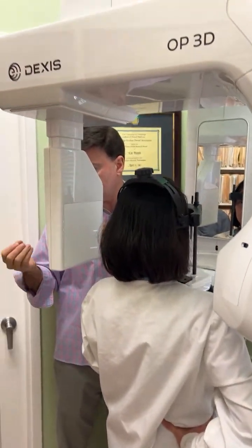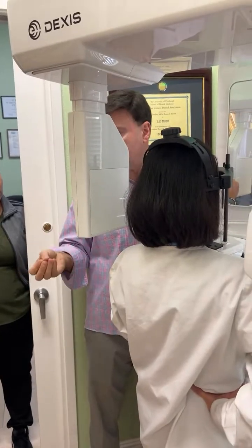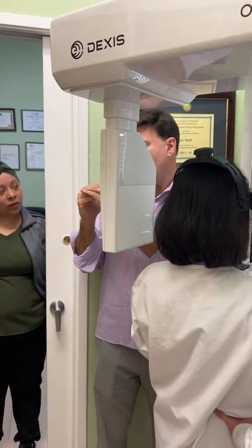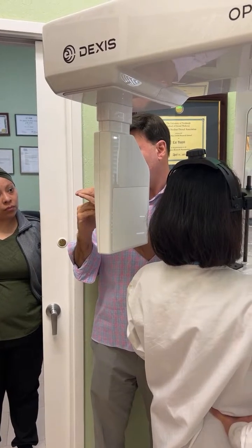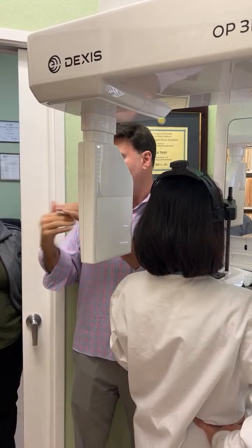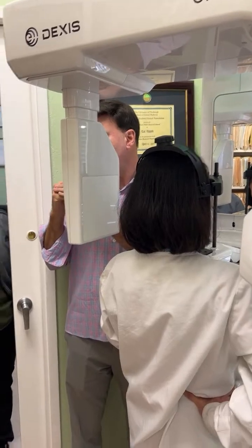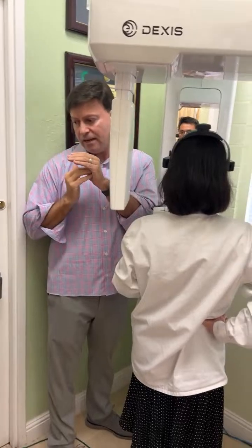Then, like this, then lock, close the head, swallow, tongue to the roof of the mouth, lips around the bite stick like you're sucking on a straw, close that, and hold it for the duration of the exposure. What's going to happen is they will relax their tongue. They won't leave their tongue out. They'll put the tip, or they'll just drop it. When I'm smushing that whole thing up on the palate, tell them on the roof of your mouth. Everybody swallow right now. Where's your tongue go? Up. Leave it up. They're going to get lazy on you and drop it.